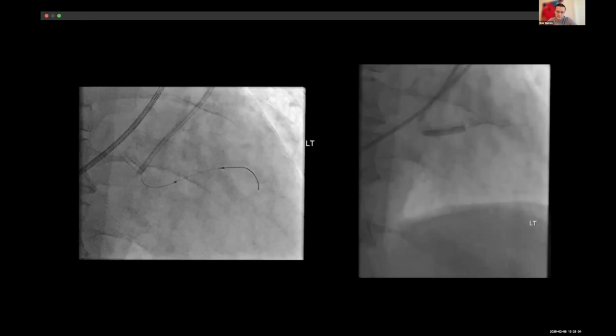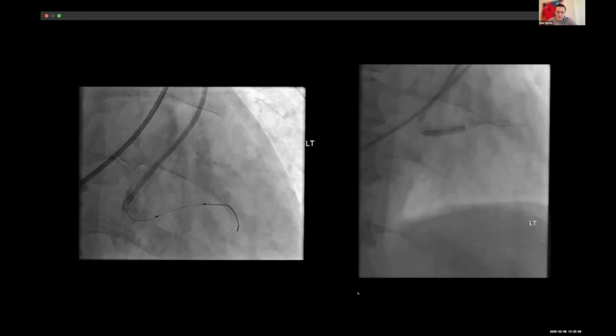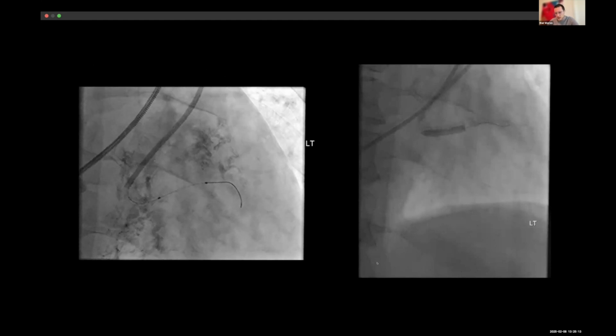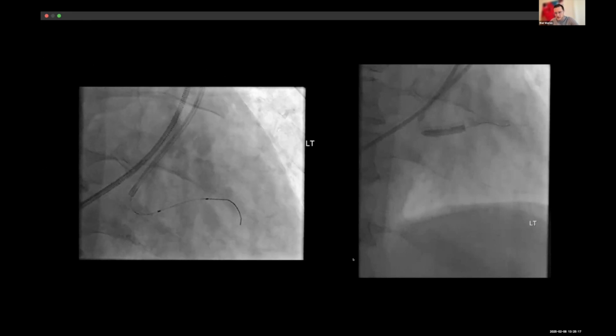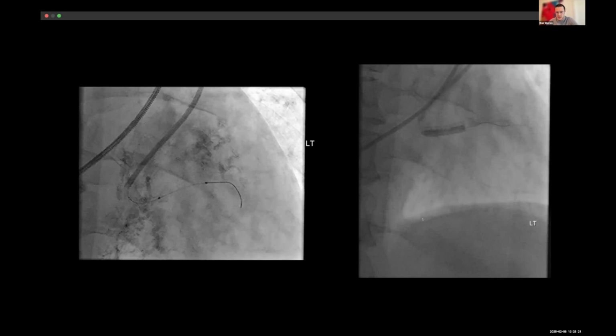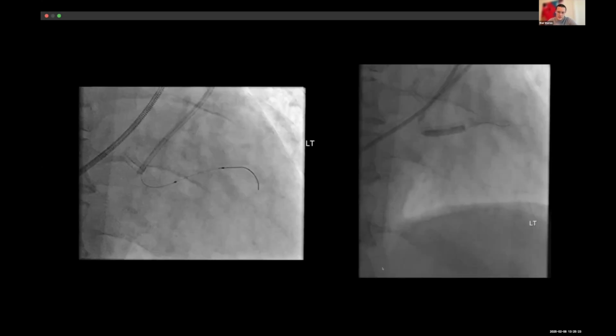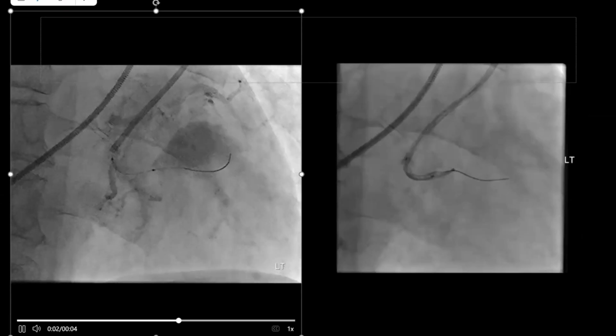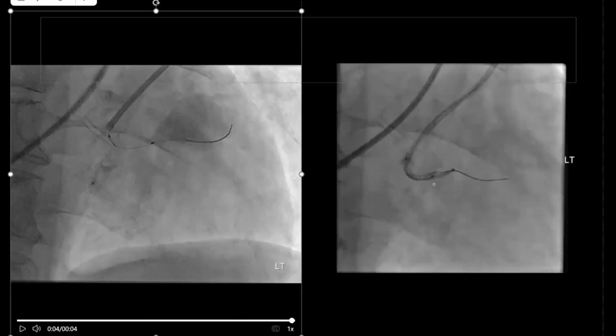Next slide. However, occasionally, complications do occur. So here you can see we're doing that check angiogram. Proximally, maybe the wire looks okay, but now in retrospect, the wire is not really following distally the trajectory of the other vessels. Angioplasty was performed nonetheless, as you can see on the right. And then we do our run post angioplasty. And then you see here that there's a large pseudoaneurysm. So there's been a rupture, a wire perforation, which has now been dilated with a balloon.